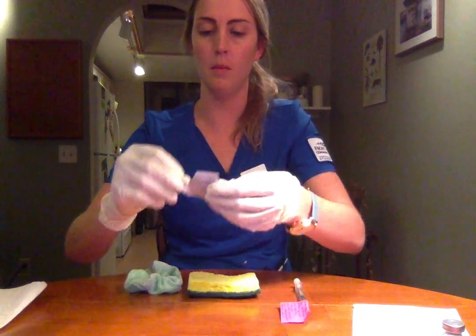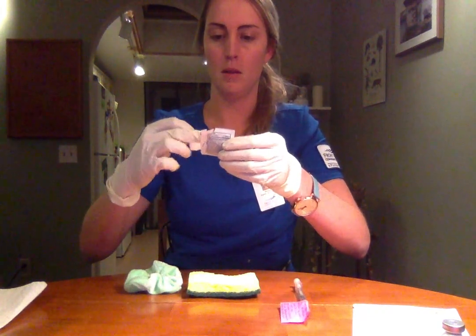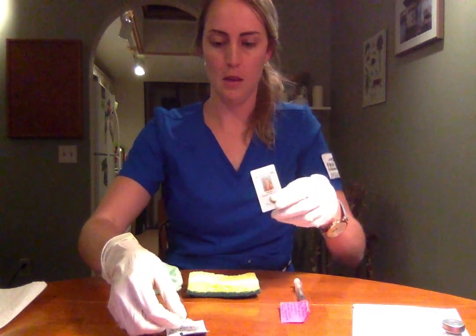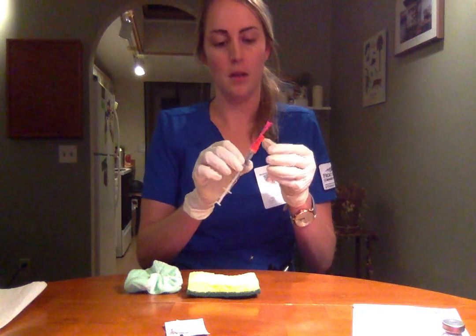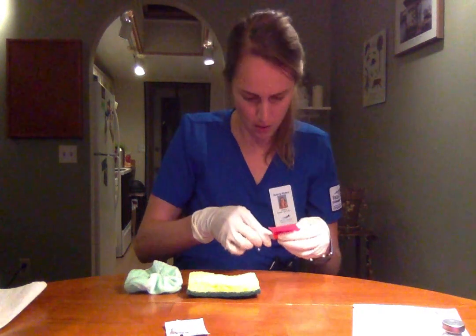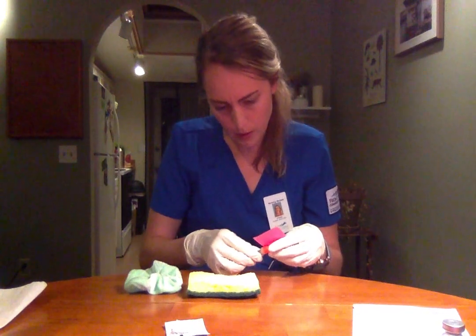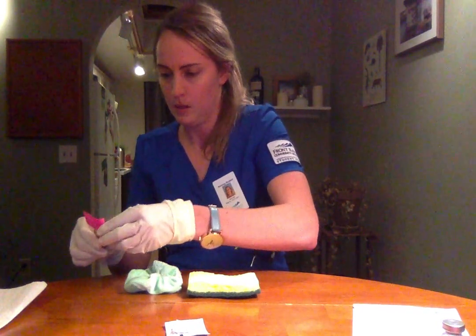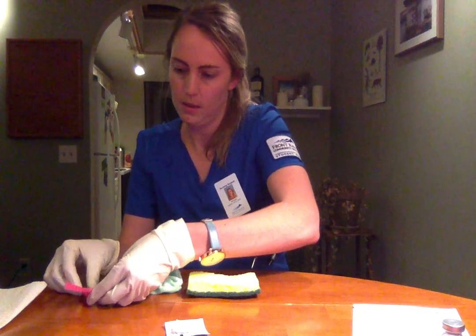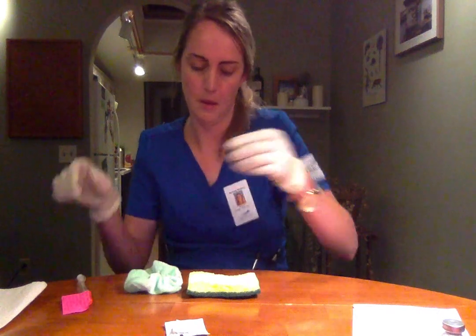So I'm going to open up my alcohol wipe. Okay, and I'm going to just loosen up the cap here. Okay. So put that down here. Okay.